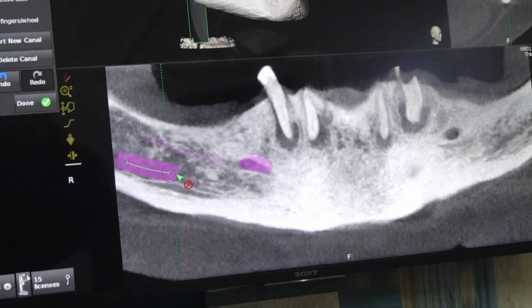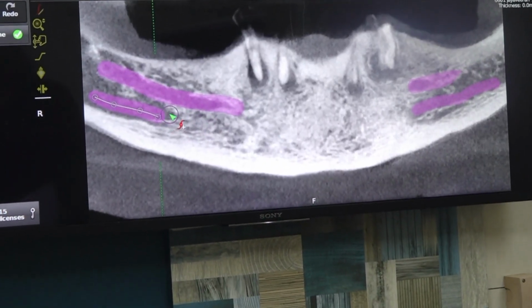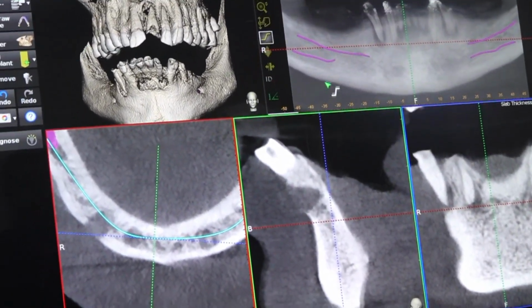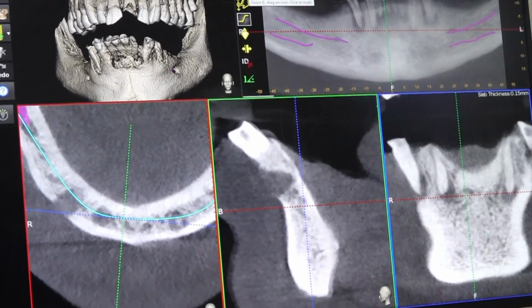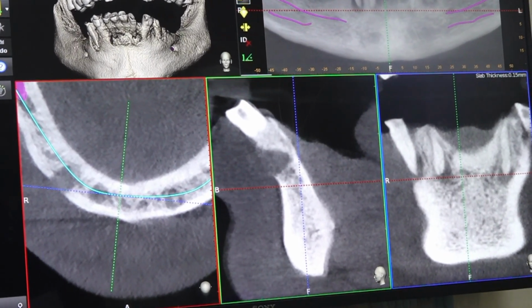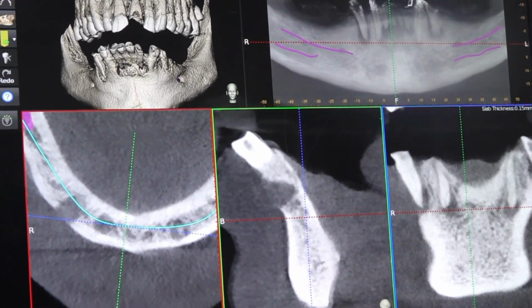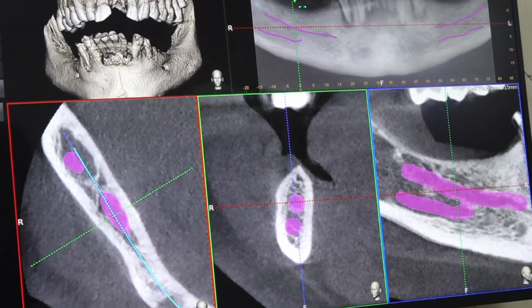It is also coming till here. Both sides we are seeing 2 canals. One is upper and one is lower. The lower, whether it is a canal or bone marrow space, we cannot really tell unless we take a biopsy, or we have to see literature, variations, and we have to correlate with the literature somehow. We have to read some articles, put it in that to the list.